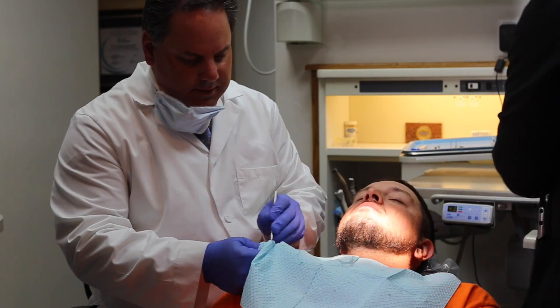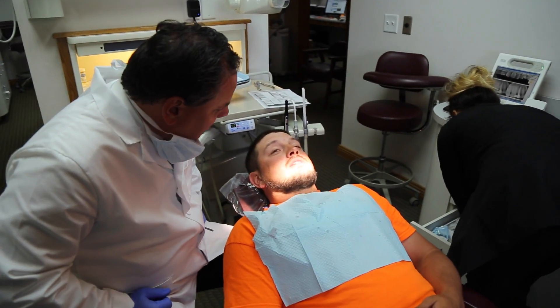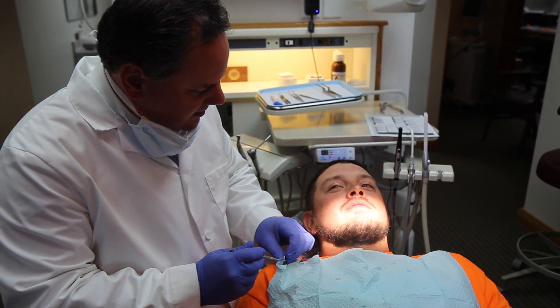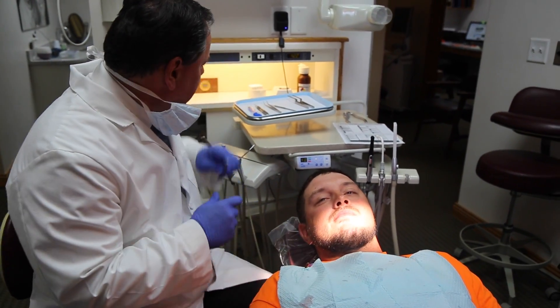We'll get the rubber dam on and start cleaning it out. Is that a good experience? Yeah, it wasn't bad at all. What did you feel? Nothing — virtually nothing. That's awesome. The needle is the worst part too, but not with you — I didn't even feel it. That's great. That's all about taking good care of our clients.